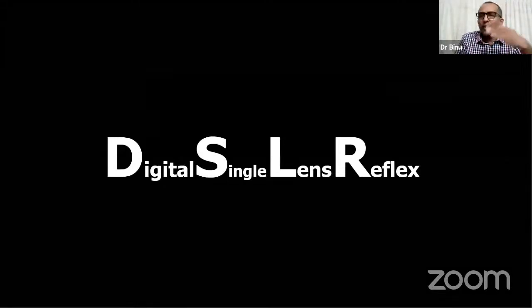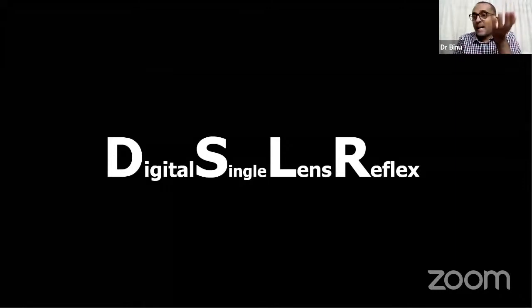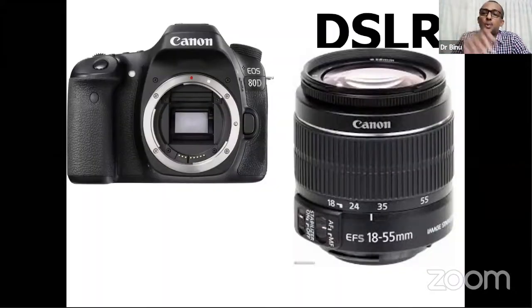But many of the things I showed you here, you can take care of with your mobiles. Maximum, an intraoral camera. But when you talk about a good photograph and an excellent photograph, that's when you need a digital SLR. The next 2 to 3 slides are exclusively for the digital SLR people.